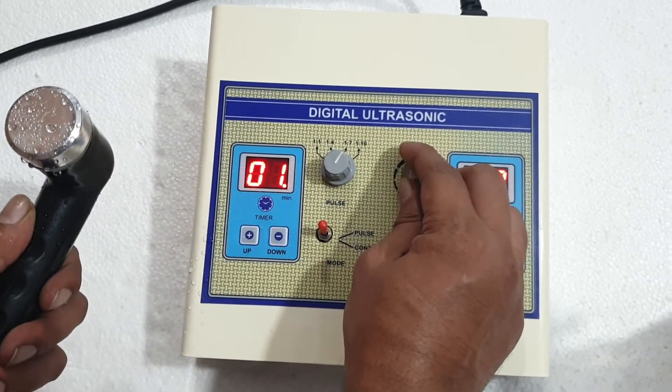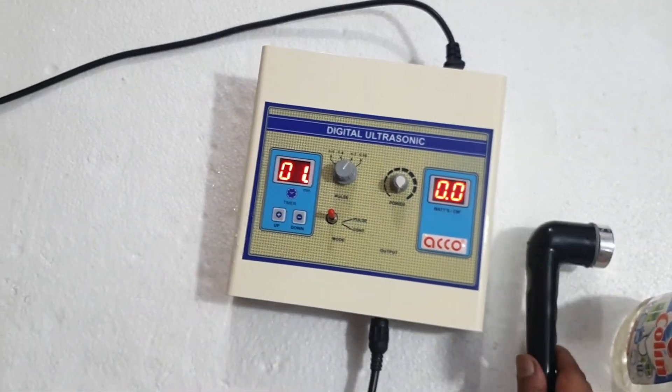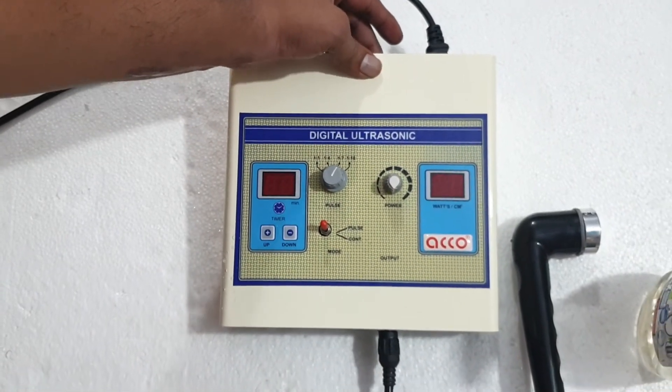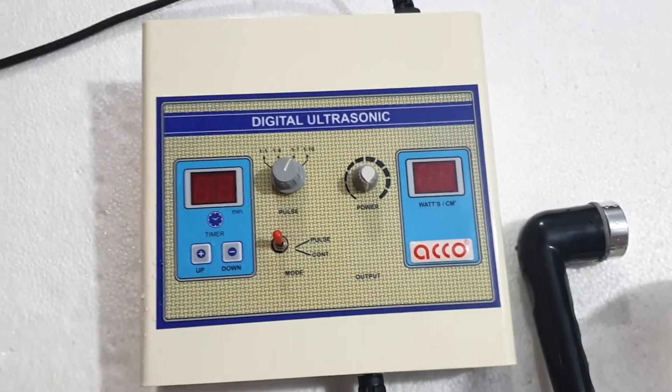Once the treatment is completed, make the intensity knob to 0, then switch off the machine. After use, clean and dry your handle properly.